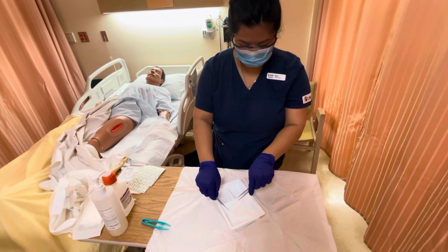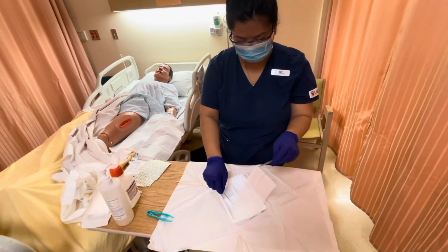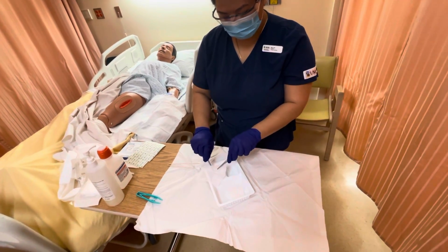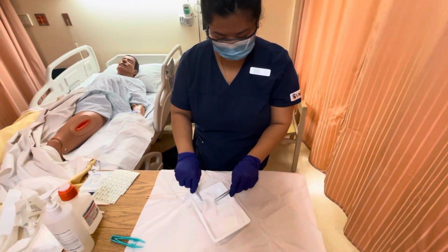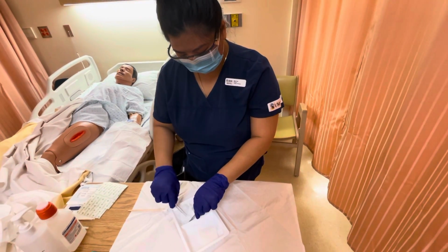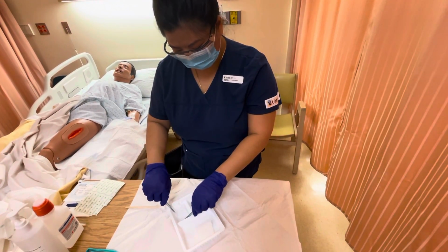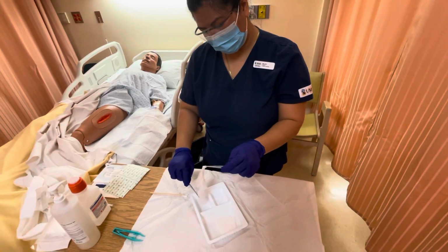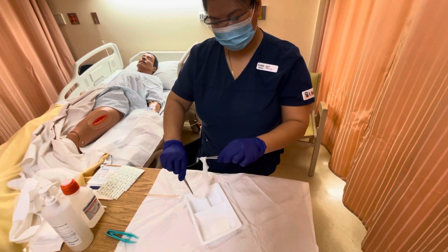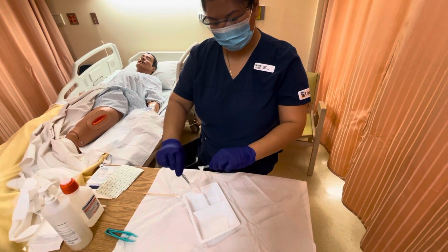So I'm just going to open up our 4x4 dressing and dip that into our solution. And I'm just going to wring out the excess, making sure that the forceps stays down.